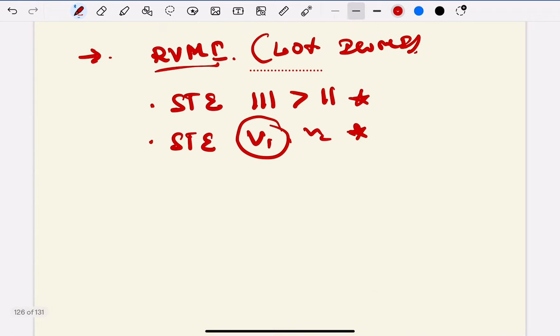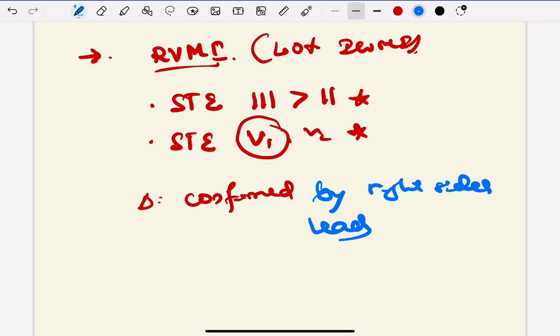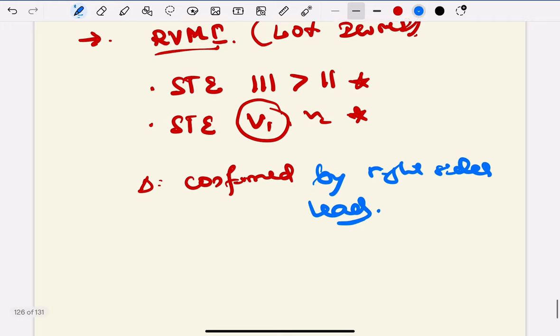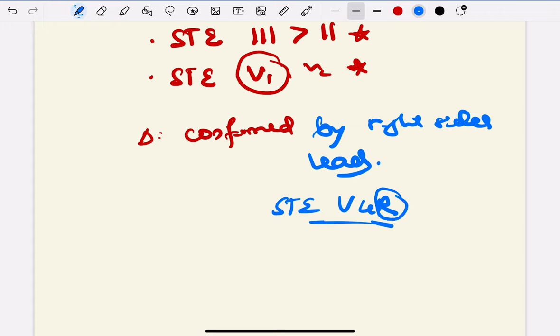Now how to confirm this diagnosis? Diagnosis is confirmed by right-sided leads. This patient showed ST elevation in right-sided lead, that is V4R - right-sided V4. If R is written here, that suggests right-sided lead. This is right ventricular MI.